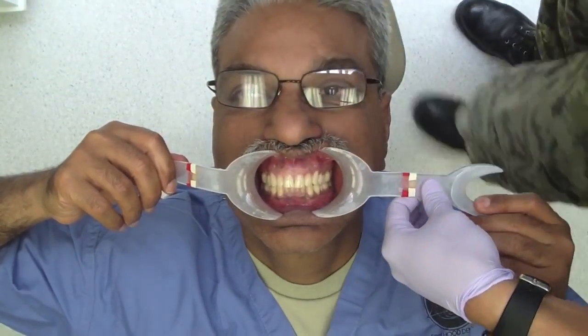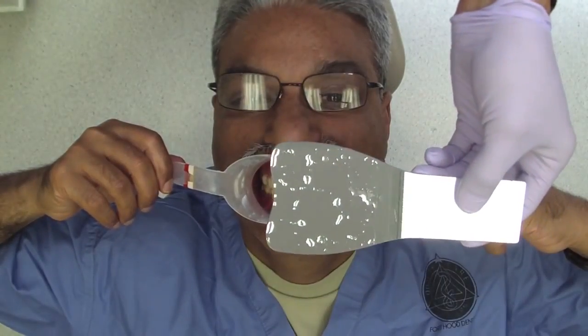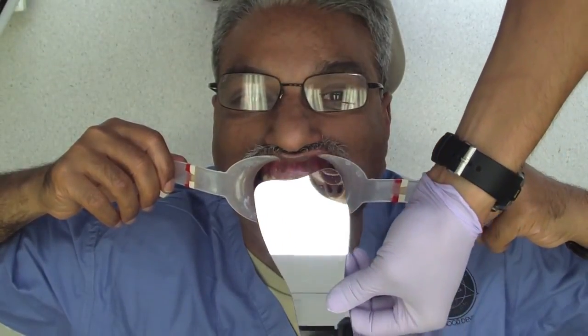this is for just learning. So the next stage, we've grabbed our buccal shots, we've grabbed our straight on shots. Now what we're going to do is use a mirror. Like I said before, I placed it in the hot water bath. You see we've got a whole bunch of water stains, water spots. I'm just going to use surgical cloth wrap just to dry it off. Make sure we don't have any water stains on it, and it's warm, so just open big for it. We'll keep those in.